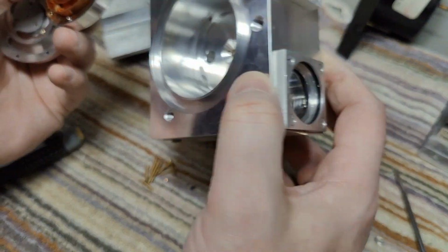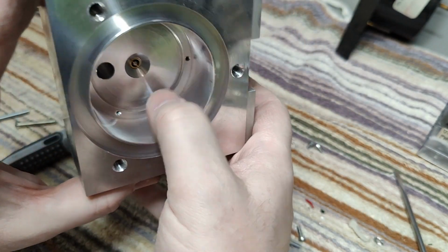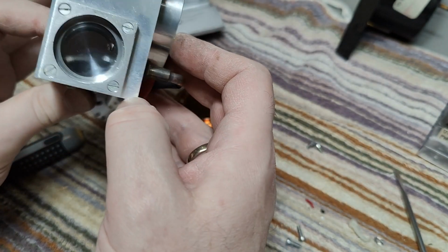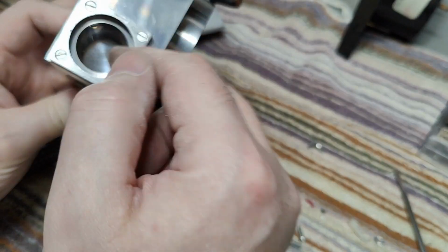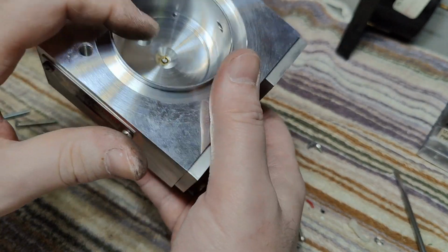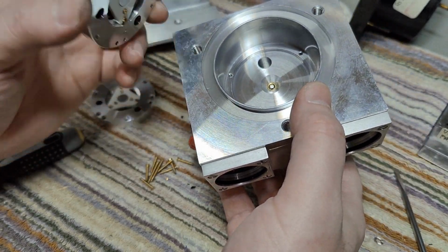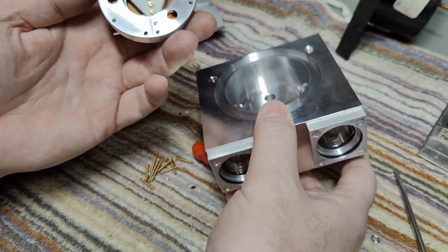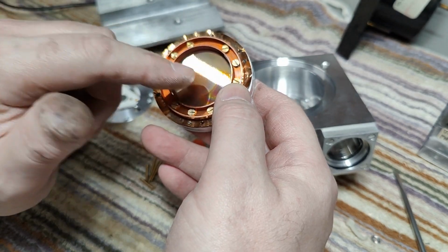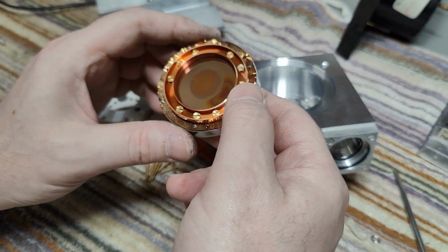And then, yeah, we got some tiny little holes here. See, here is a hole that goes to that piece, and this is completely closed. So it's light that goes into a room, and somehow you're able to create some sort of a pressure difference or some magic something that can be detected using an ultra sensitive oscillator, and then this capacitor changes the oscillation frequency and stuff like that. So how is that working? I am completely puzzled.